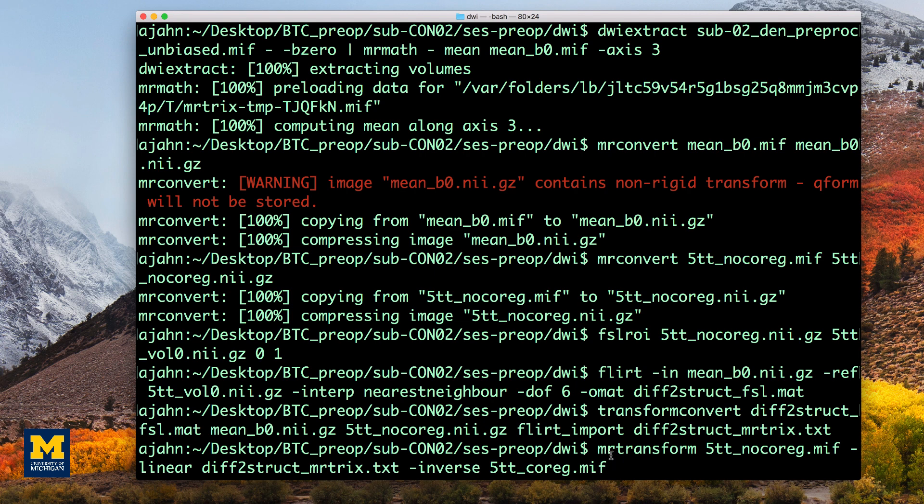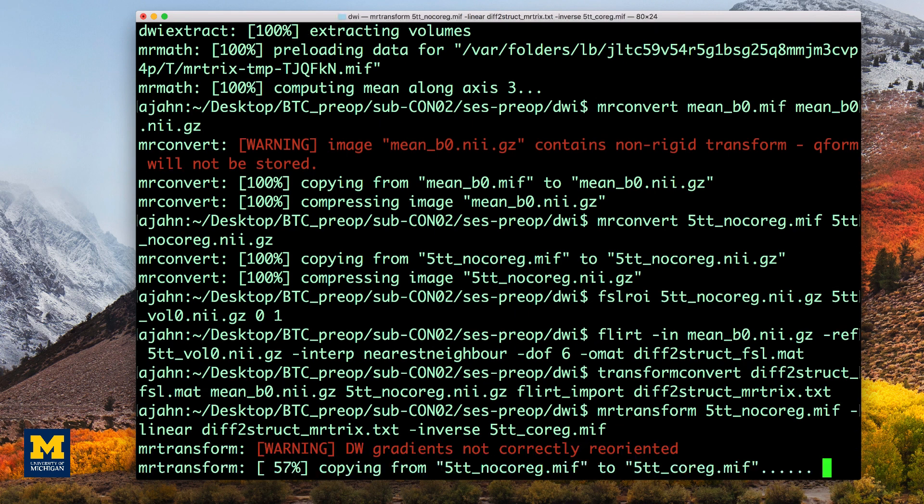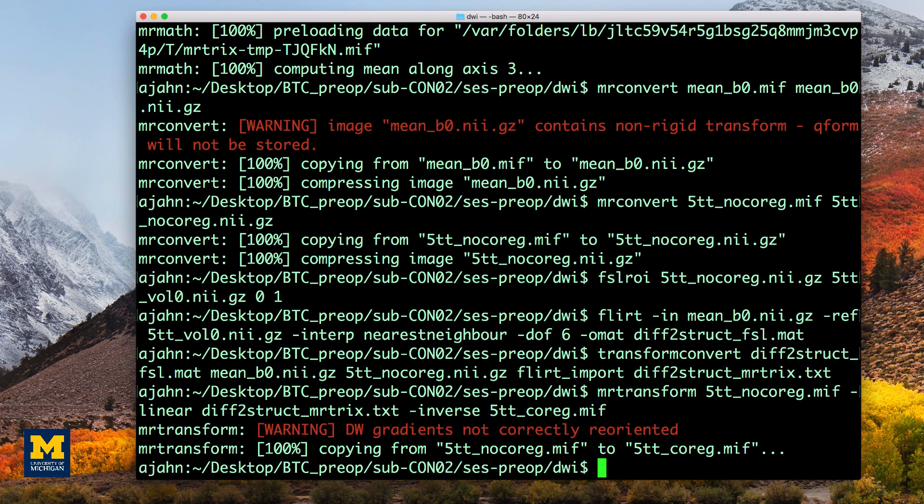This command takes the 5tt image that hasn't been co-registered yet and then applies the inverse of the diff_to_struct transformation matrix to create a new file called 5tt_coreg.mif.